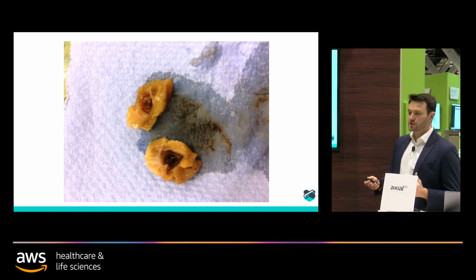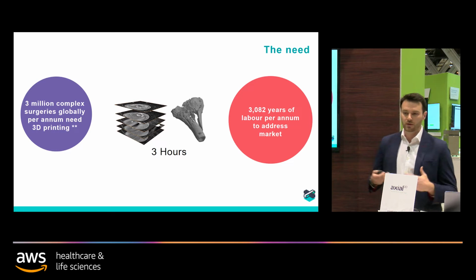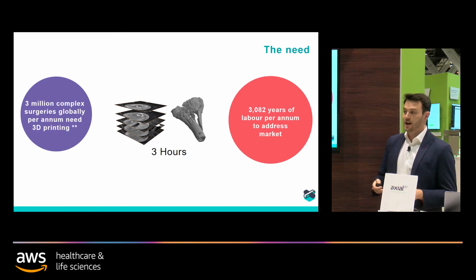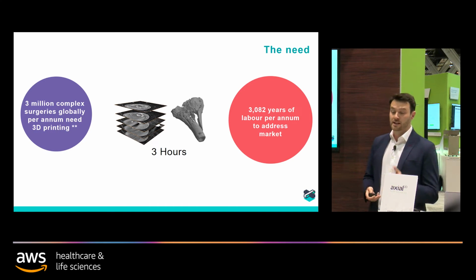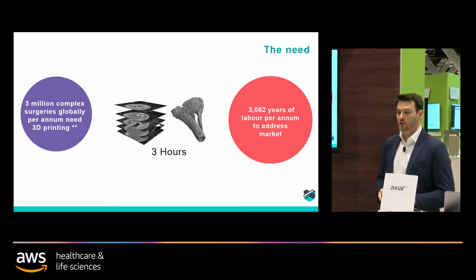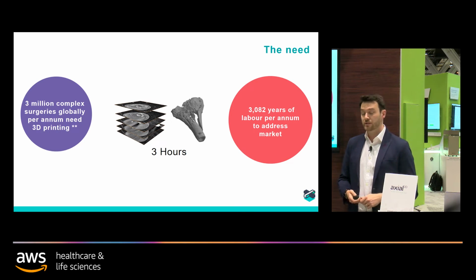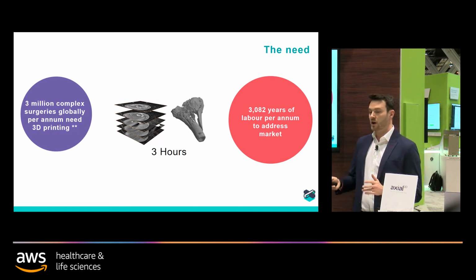But there was a huge thing that was stopping the worldwide adoption of 3D printing. And it's a process called segmentation. So you'll see it all around the booths here today. What I'm talking about when I talk about segmentation is basically the process of annotating two-dimensional medical images, so CT and MRIs, to create an STL file, so a file that's specific for 3D printing. And to put it into perspective, Jonah's spine case takes around 4 or 5 hours to actually process that data manually.